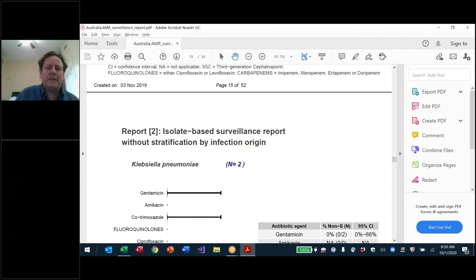And even if they're doing good quality testing in Hospital A, they may be doing different drugs than Hospital B. We're trying to get those to standardize. So I would have one special focus on the best facilities to make sure that they really are doing good quality complete testing with good quality data management. I would also recommend, if your time and resources permit, to work with as many laboratories as you can manage in visits and in conversation and getting their commitments.